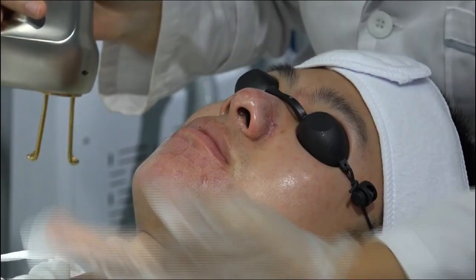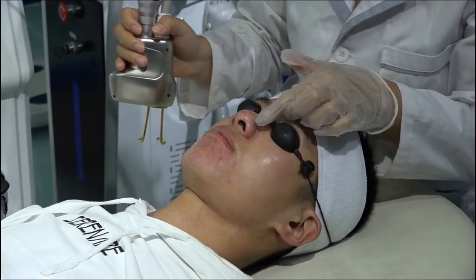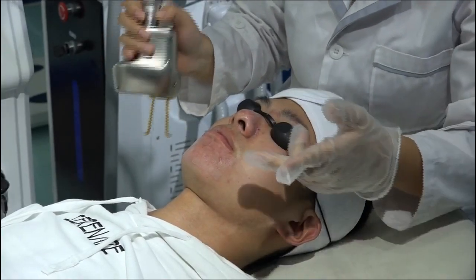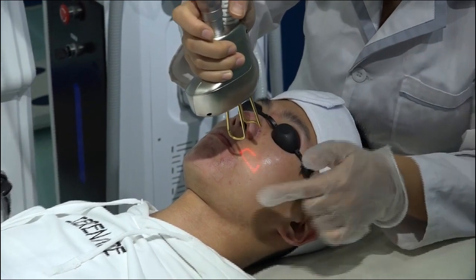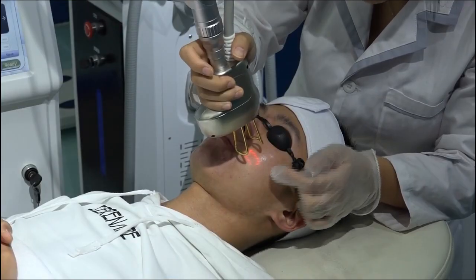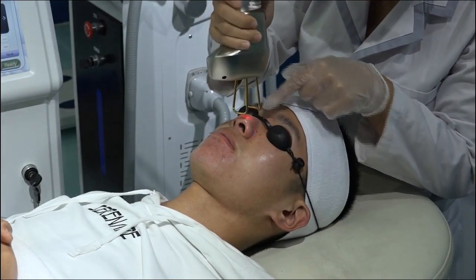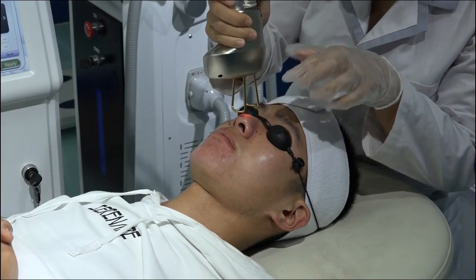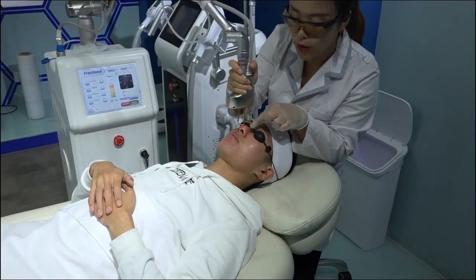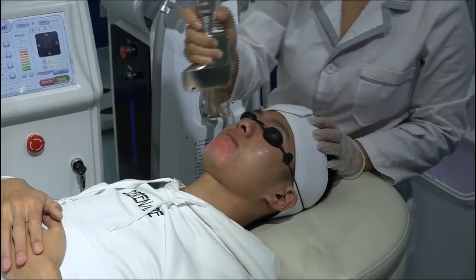Okay, we finish all the acne removal for the mouth area and also the nose area. Every area we just do one time, it is okay. Every time I put the handle here and I will see the shape preview of the treatment area like this. If there are some narrow areas, I will put the handles here, see the area. Then I will adjust on the interface the width and lines to adjust the size. Here, it is okay.